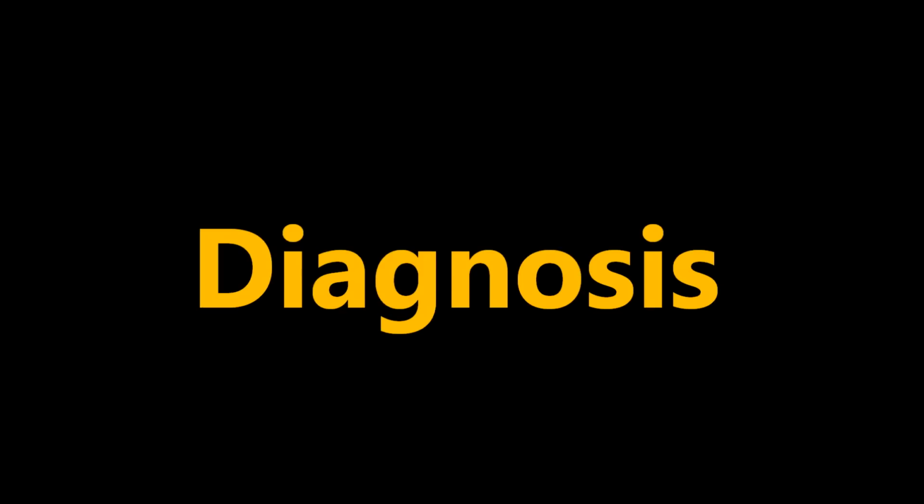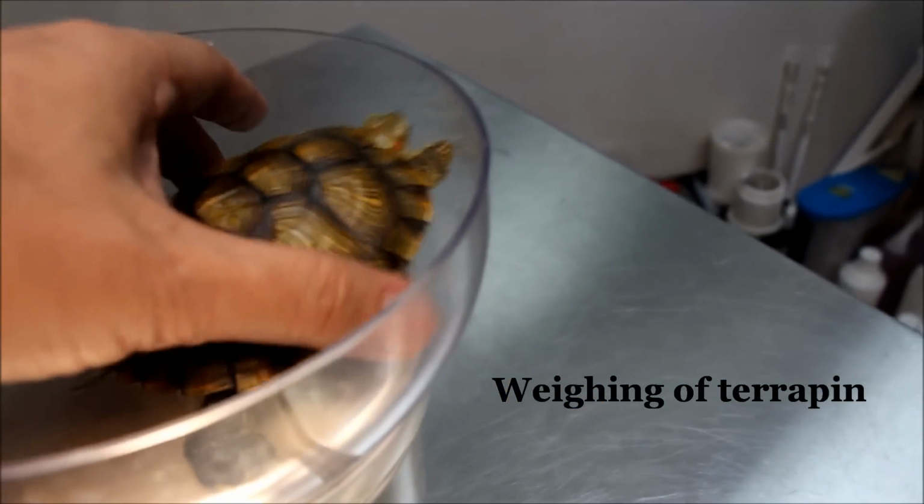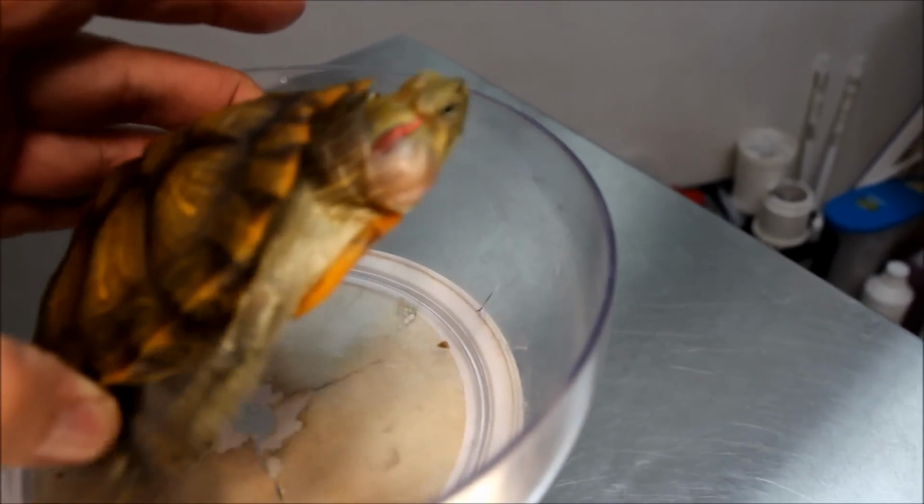In order to perform a proper diagnosis on the terrapin, we first had to perform a physical examination on it. Here, the terrapin is being weighed by being placed on a weighing scale. The purpose of the weighing is to check if it has a normal weight.